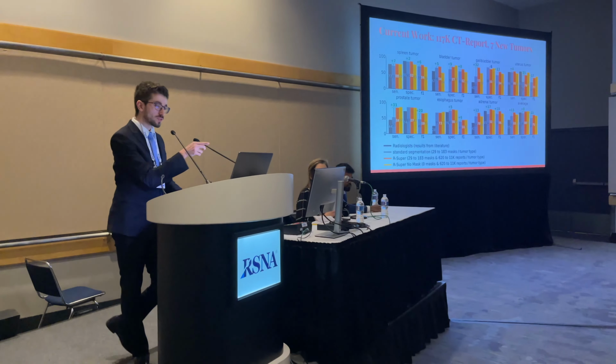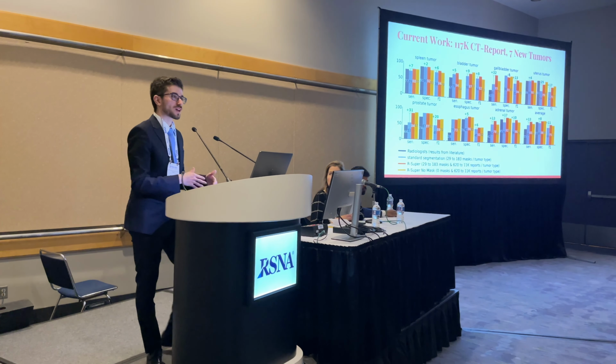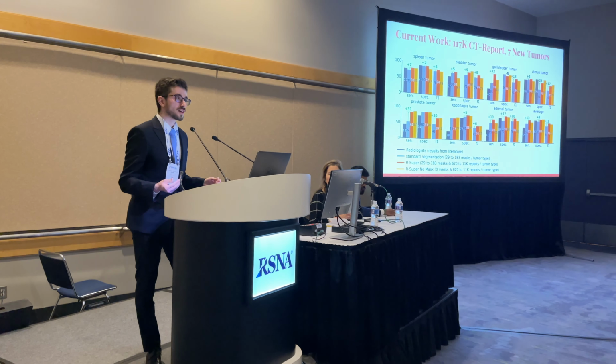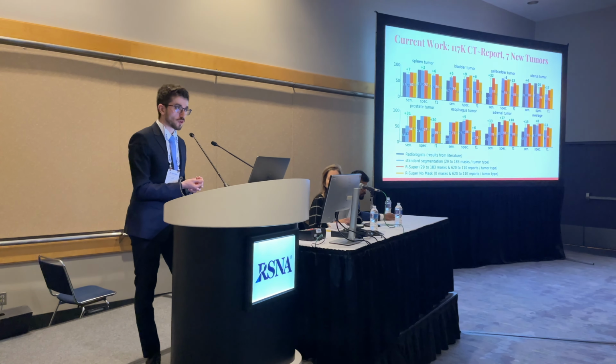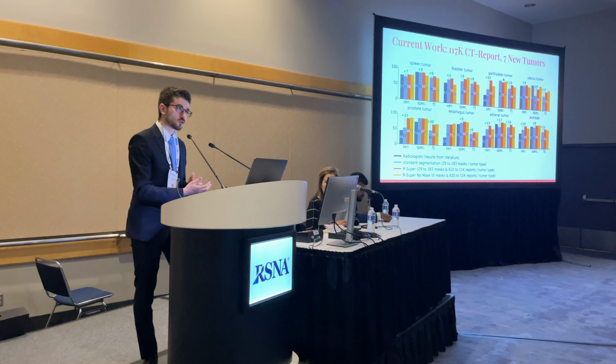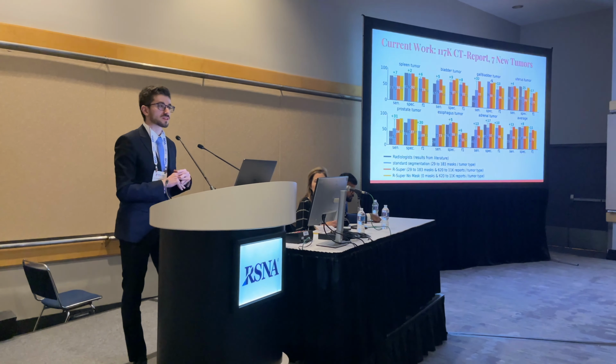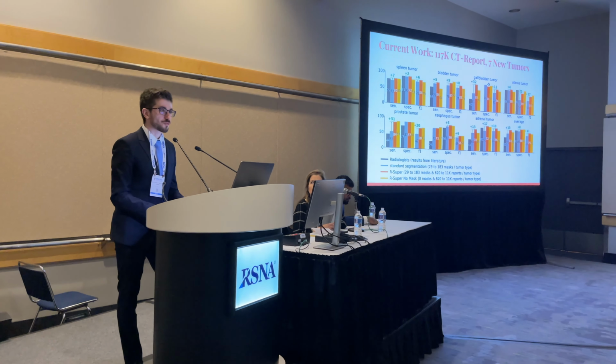Yes, it's all 3D, great question. So yes, actually in this work, we are using it to help us label this data set. So we have 100,000 CT scans. We train first only with the reports, and then we create masks, and the radiologists improve the masks. And we have this active learning loop to annotate this data set with the help of this model. So yes, for CT scans, super easy to implement, just go to our GitHub.